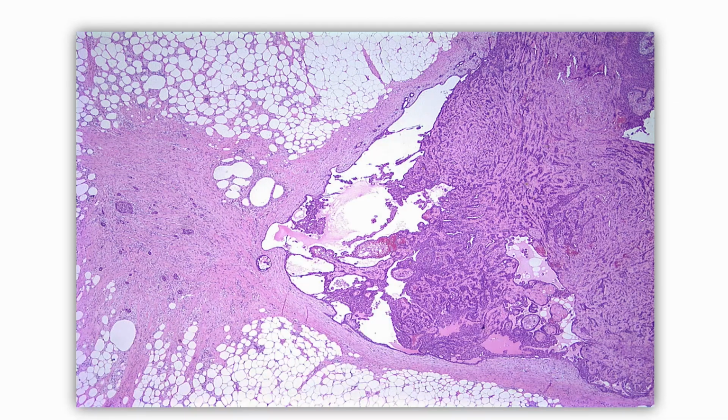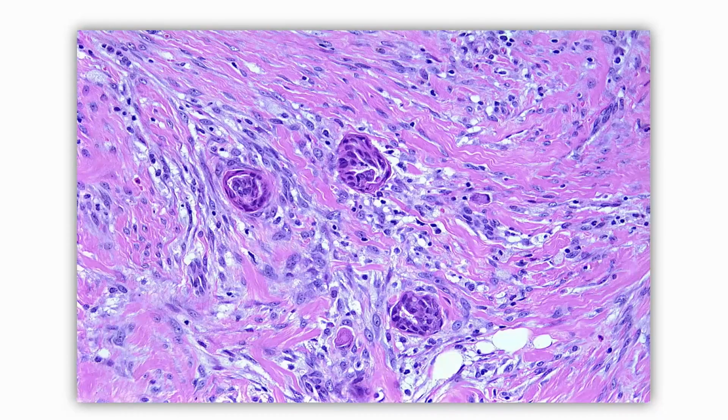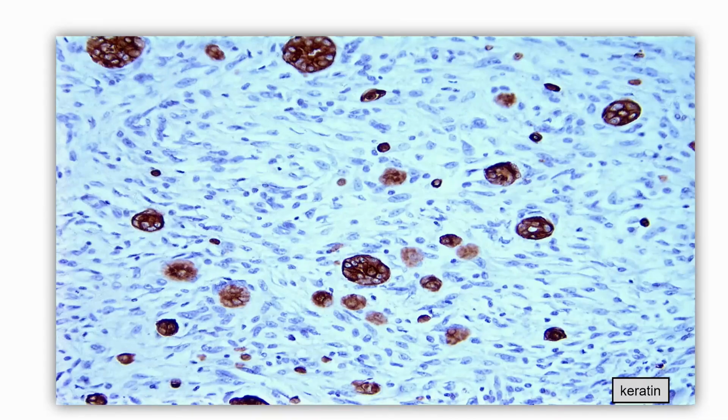So most patients who have excisions nowadays have already had fine needle aspirations or core needle biopsies. And so you'll have situations, here's a benign intraductal papilloma, and here is a sort of cellular stromal area with some epithelial cells. And it doesn't have that lobular-centric arrangement. They look very haphazard. They look kind of atypical. And so, again, if you're not thinking about the possibility of displaced epithelium, you can make a mistake.